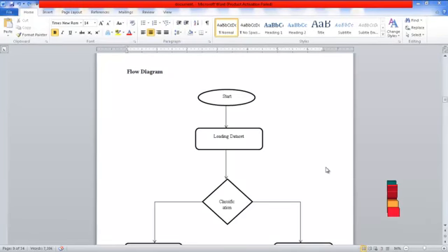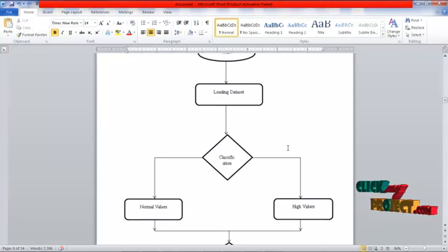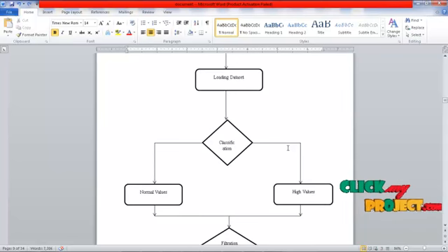In this process, first we load the dataset from the input. It is the signal waveform. From that we can classify. Classification means the normal values and high values will be separated. Then using this, it will create the transforms. By the operation of the transforms, it will do four methods.